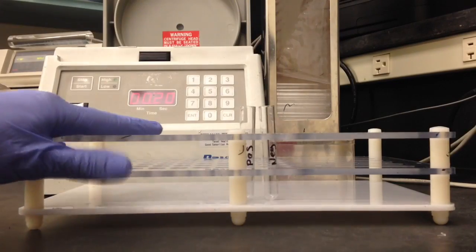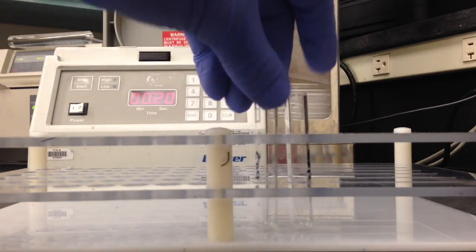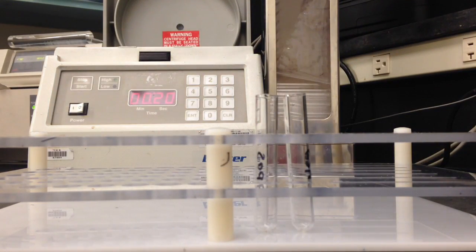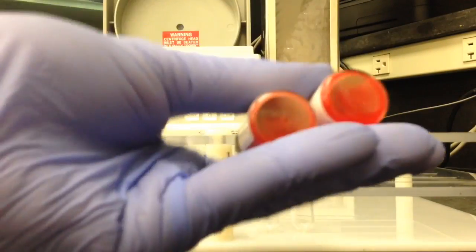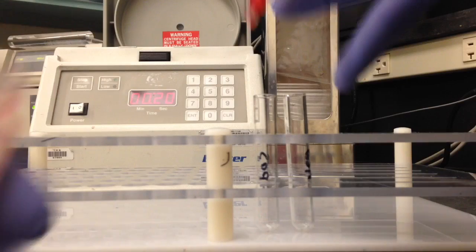So the first thing you're gonna go ahead and do is label your specimen tubes. Like I said I'm just doing the positive and the negative control. Then you're going to grab your positive and negative control, make sure you mix them really well, and then add one drop to the appropriate tubes.